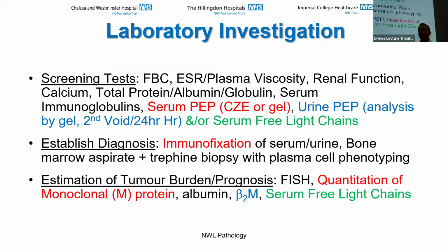So within our laboratory, these are the frontline tests which we should consider. In particular, in the protein lab tests, which I will basically concentrate on, we're going to look at serum protein electrophoresis, a little bit on urine protein electrophoresis, and mainly also focusing on serum free light chains.